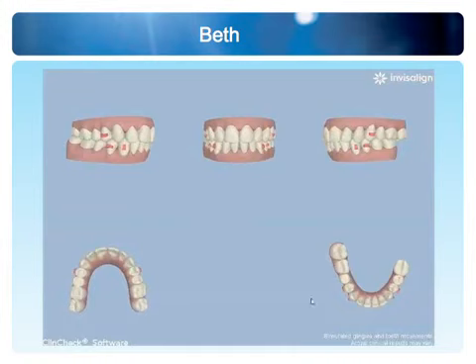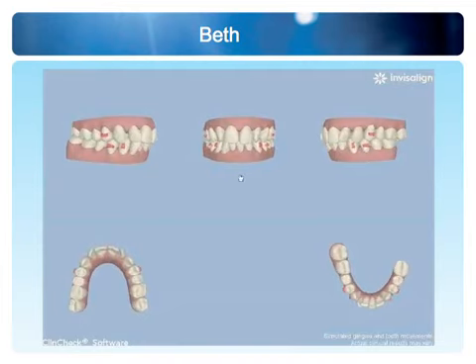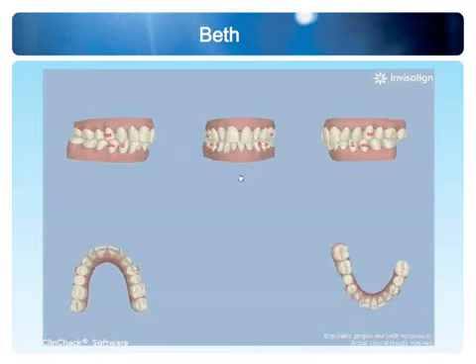I started at the canine, number 22, and there was 0.5 here and 0.5 between the two premolars, and 0.5 between 19 and 20. And 1.5 was the total IPR count for the lower arch to unravel what could be, if you're looking at the 6 teeth, maybe 5 millimeters of crowding, something like that.